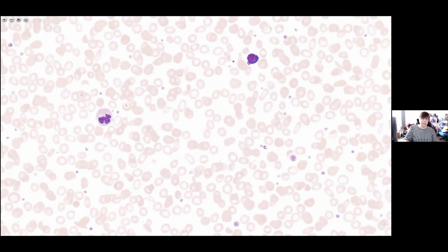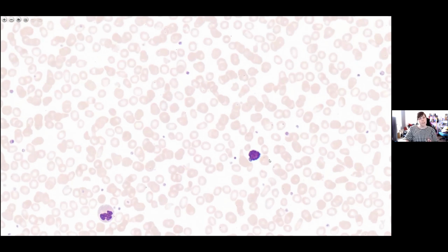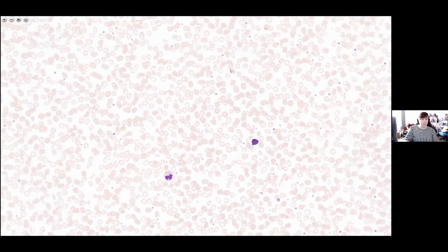And so for this case, compared to the first case that we had, the first thing that strikes me is, while this patient is hypochromic microcytic, they are not anemic. And that's an important thing to remember. They do have something that is making their red cells smaller than they should be, but it hasn't caused them to actually become anemic. The other thing is they don't have any symptoms of anemia. This is a booking blood, and it's being used as a screening test for the patient.